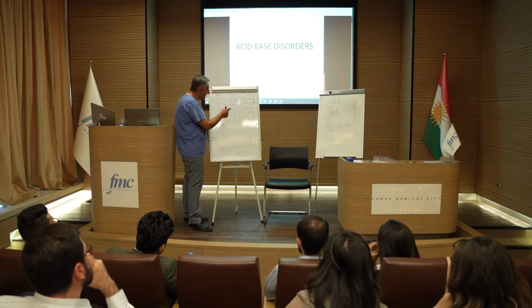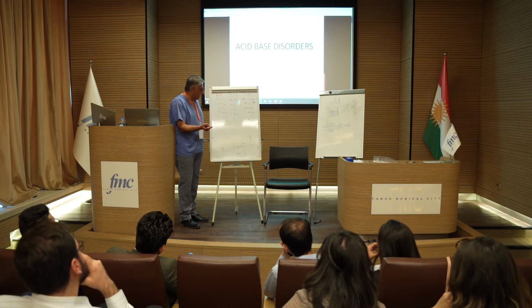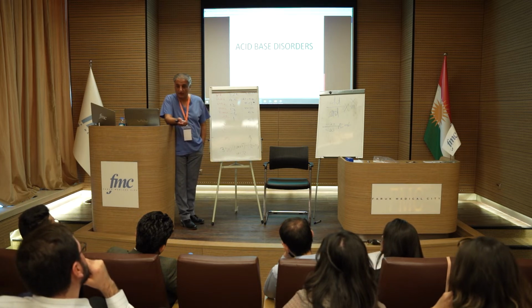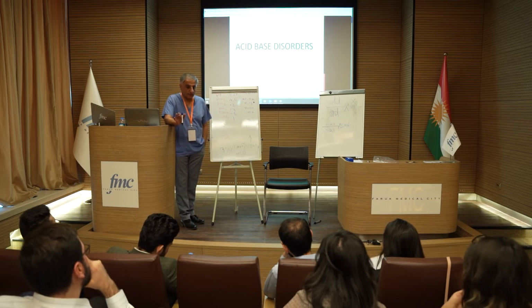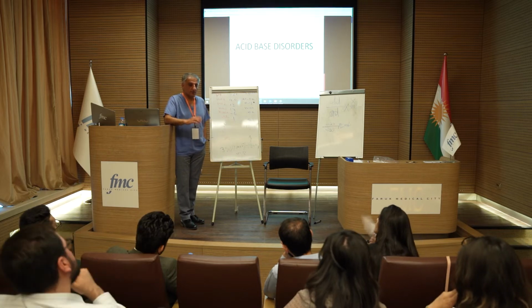So how do you treat this? Where does the acid come from? Lactate is 1, so it's not hypoperfusion, not hyperlactatemia. Lactate is normal.